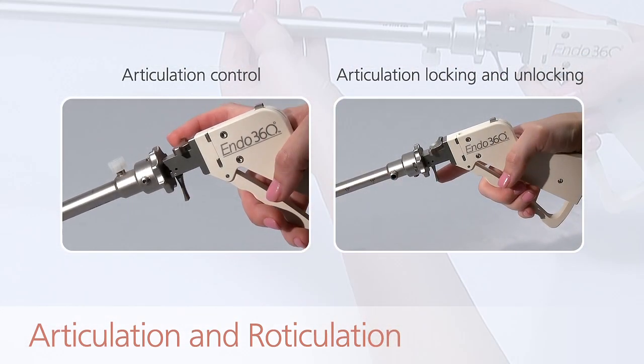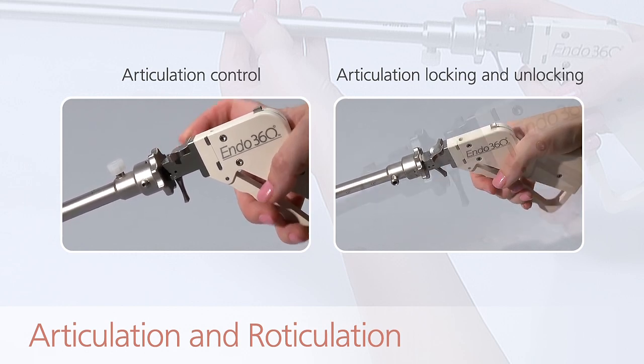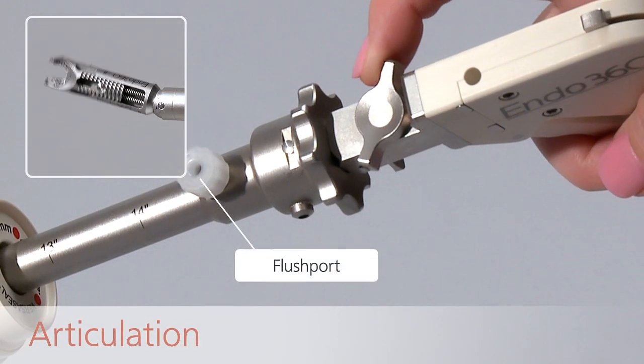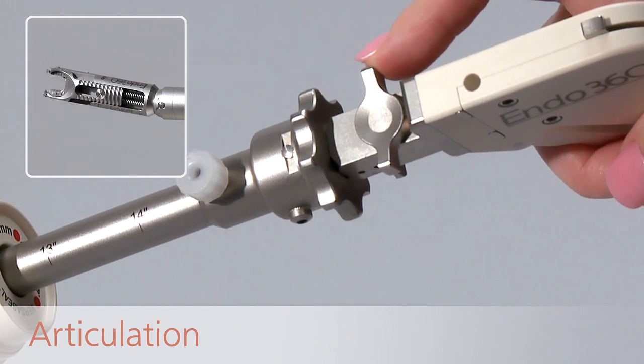The articulation control and the articulation locking control can both be manipulated with the index finger. Moving the articulation control back and forth with the index finger moves the suturing tip to the desired angle.